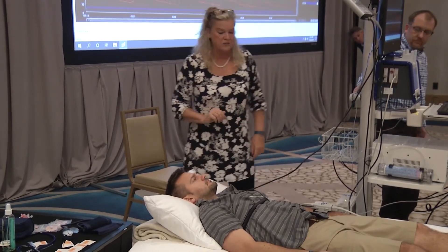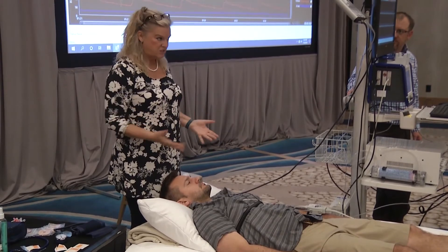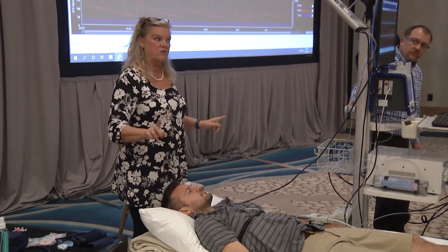A lot of times when you start talking to the patient, their heart rate will go up. So let them get a nice baseline and then just start — don't start talking to them about what you're going to do, because then their heart rate's already elevated and you have to start over with your baseline.